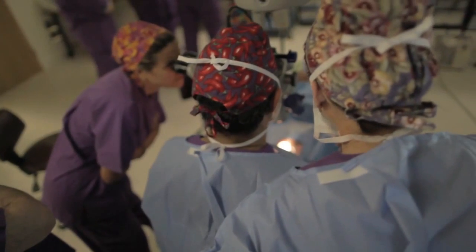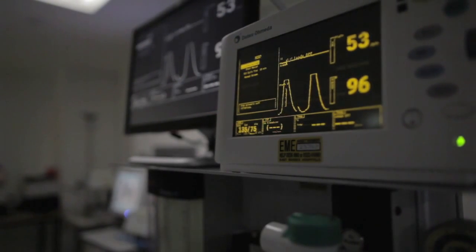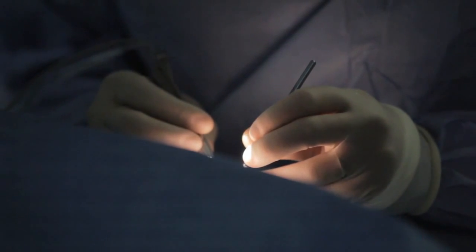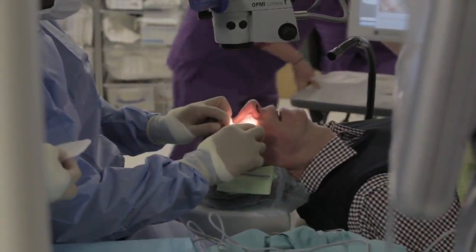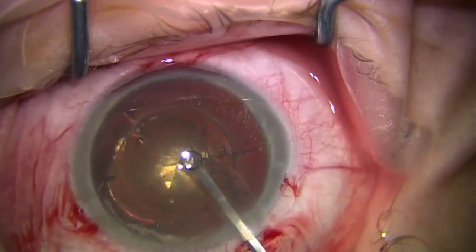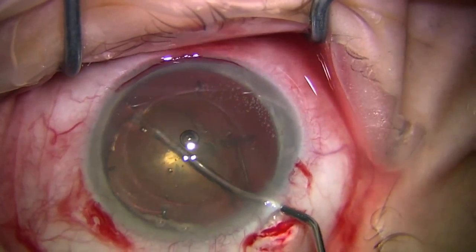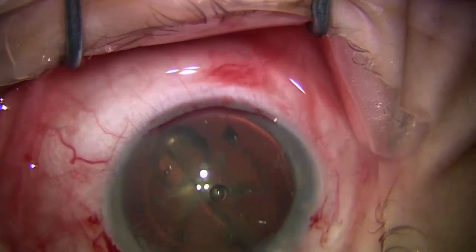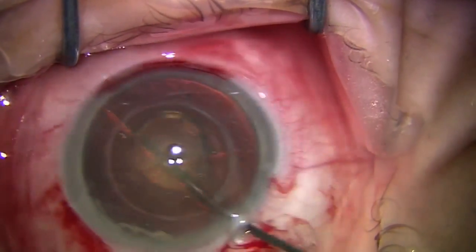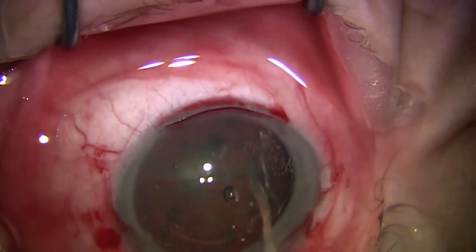For this reason, many laser cataract surgeons perform hydrodissection cautiously or not at all, preferring to break up the lens with a chopper, releasing lenticular gas, and then shoehorning each nuclear fragment. On one occasion, while performing this manoeuvre and breaking up the lens with a hydrodissection cannula, fluid was mistakenly injected resulting in a perfect fluid wave with good lens mobilisation. The procedure was repeated purposefully and successfully case after case. Translenticular hydrodissection was born.